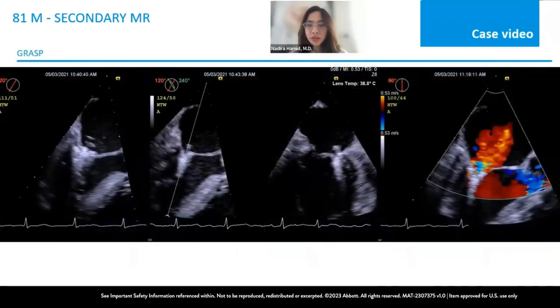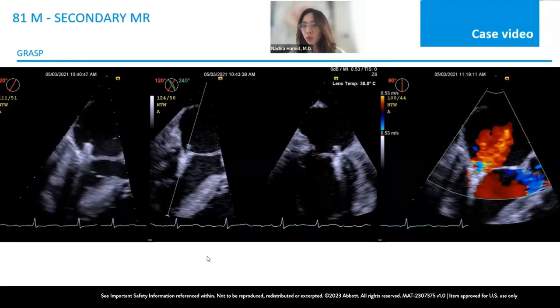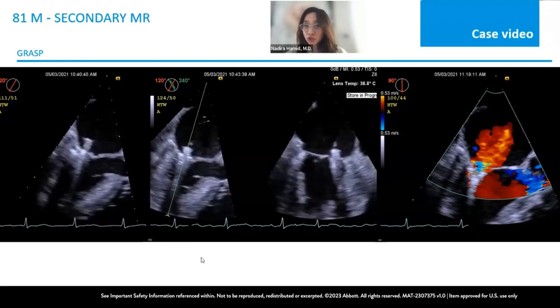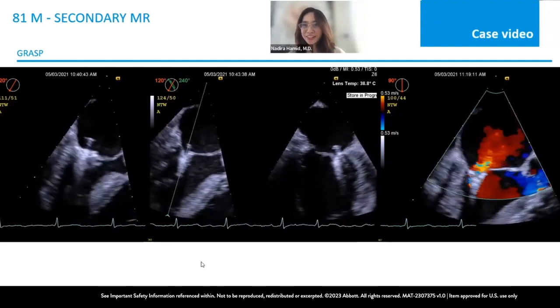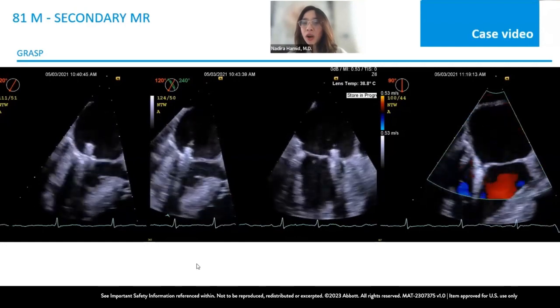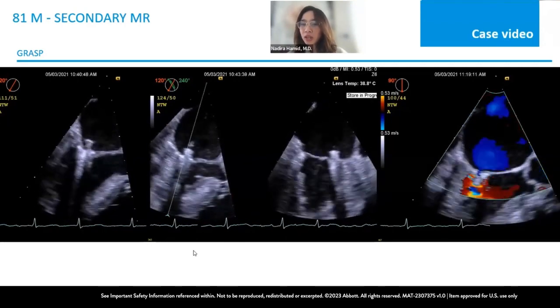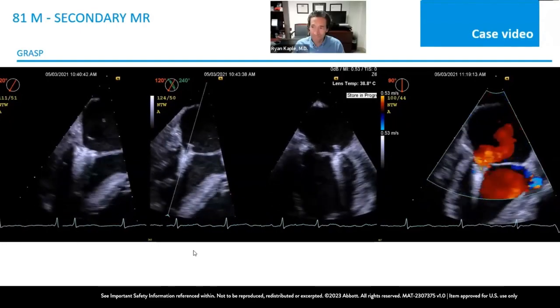And Ryan, I think we have a question, and it is a very good question. How often, at this step where you feel that there's not enough height, do you think you have to redo the transseptal stick? How often in such cases? That's a great question. And as an interventionist, what are the things you should avoid, and instead rely on device manipulations to overcome a less optimal puncture location?